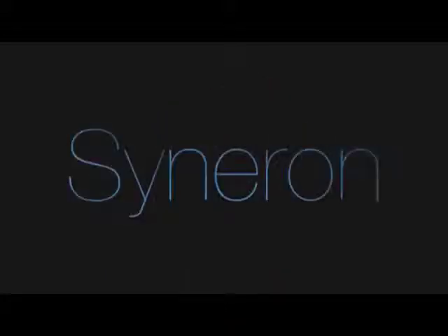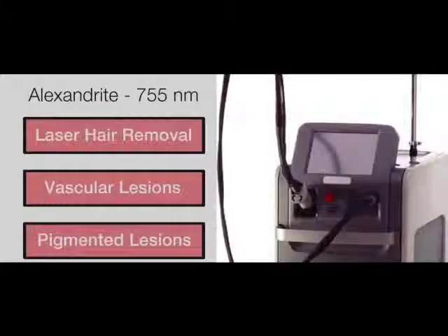Gentlelase Pro Alexandrite 755 nanometer wavelengths for laser hair removal, the treatment of vascular lesions, and the treatment of pigmented lesions.